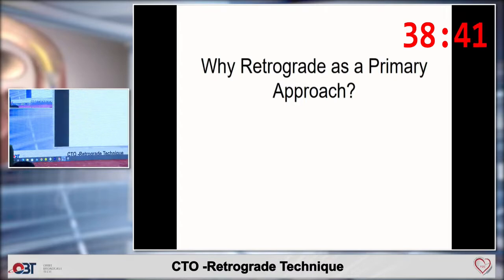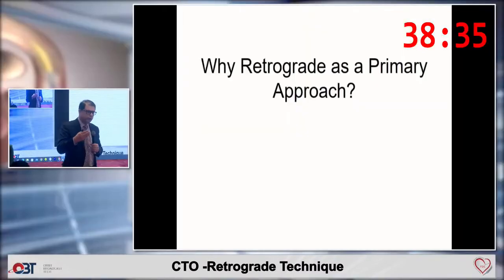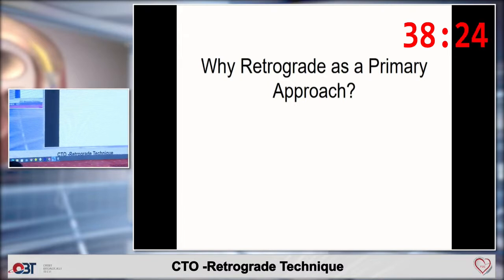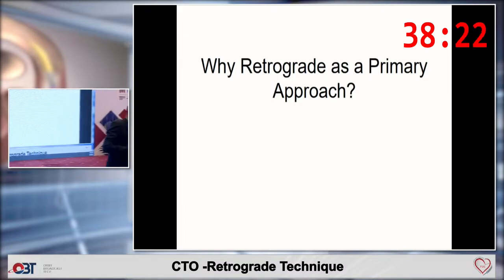You can, yes, take another. And then, yes. Normally you have 7 and 8 French guides in CTO PCI, so you can take through that guide 2 bits of equipment. Yes, that's very important. So balloon tamponade is very important.